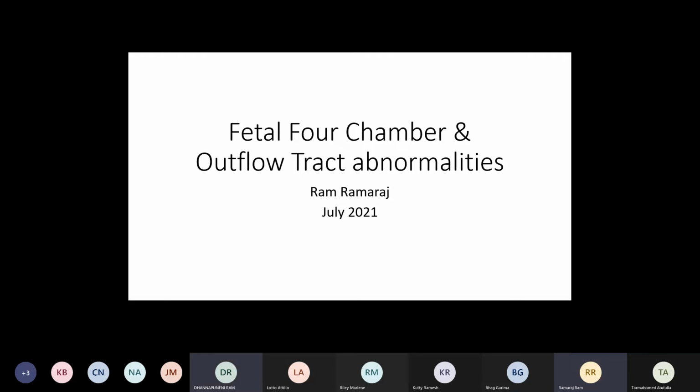But as I said, like the early first trimester scan, we do occasionally scan at 14 weeks, 15 weeks. These are for women who lost a previous child, or have major congenital heart problems, or major NT thickness, but we still need to see them between this 18 and 22 weeks window to reassure. And again, it's the same scenario: if something is suspicious but not sure, even at 22 weeks, then that needs follow-up.